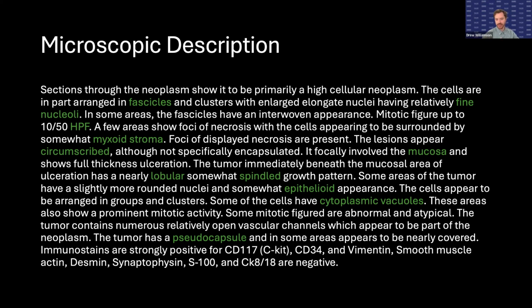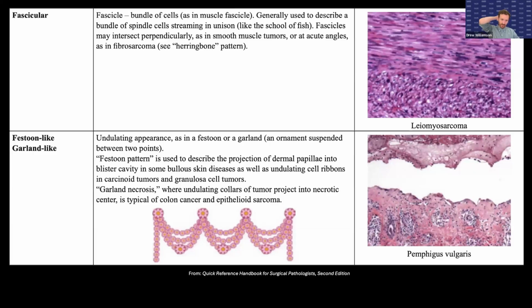We've been using these natural neural networks for 130 plus years, looking at H&E stained images of cancer. And we've come up with this jargon that is very information dense in conveying things to other pathologists about what we're looking at, and therefore making a diagnosis and characterizing this disease. And this is one of my favorite pathology textbooks.